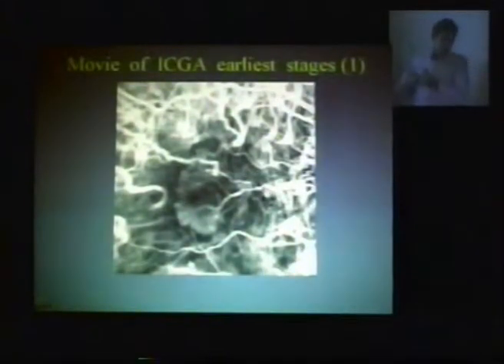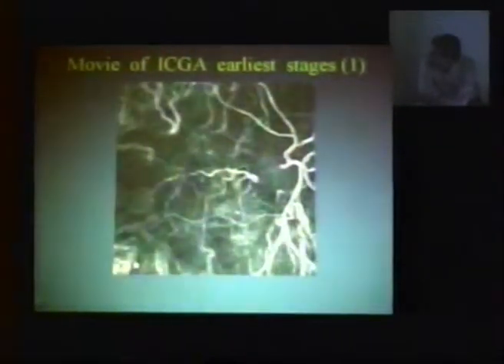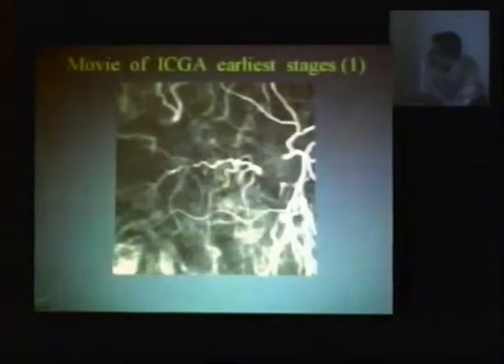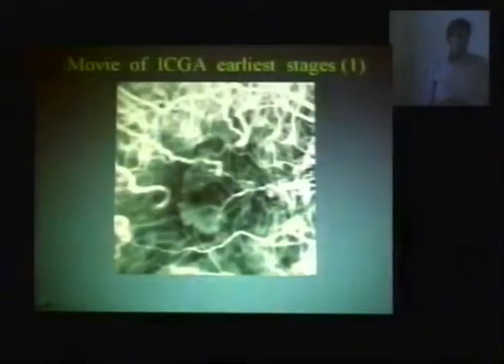Questions? Okay. Want to see again or see another one? Okay. Again? The first second, that is the beginning. And you stop it again. And you start and stop. You see there very clearly. Okay, because everything here is dark. But if you continue, in another 2 seconds, now it's already difficult to see because there is so much light around. So you do a movie, and then you study it again and again until you see the second where it arrives.